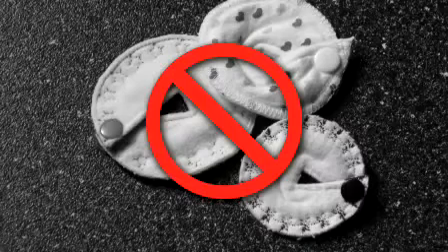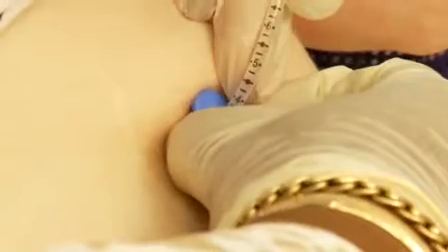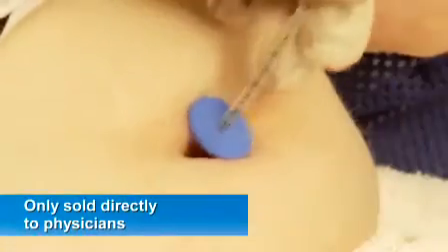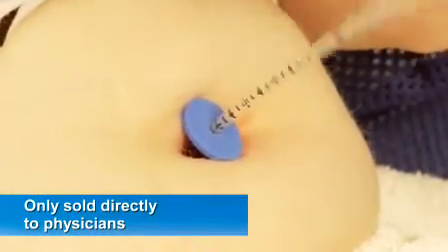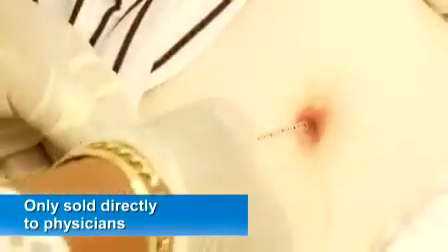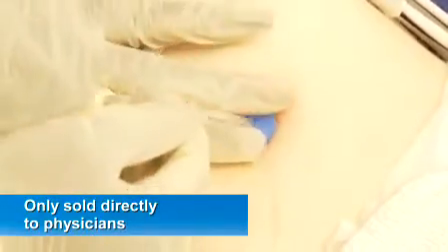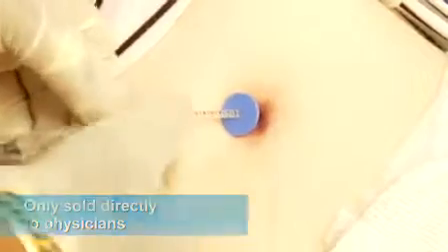You shouldn't need gauze or pads. If there is leakage from the stoma, the button may be too long or too short for the stoma, and the site should be remeasured. As the button user grows, ask your healthcare provider to remeasure the stoma on a regular basis with an AMT stoma measuring device. Babies and younger children who are growing rapidly should have their stoma lengths remeasured more frequently as determined by their healthcare provider. Buttons can dislodge if they are too short for the stoma's length, so it is important to remeasure regularly.